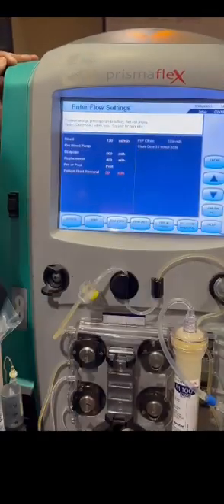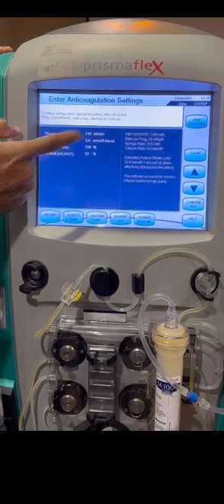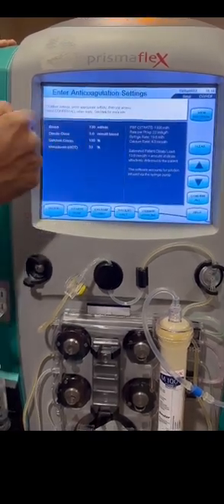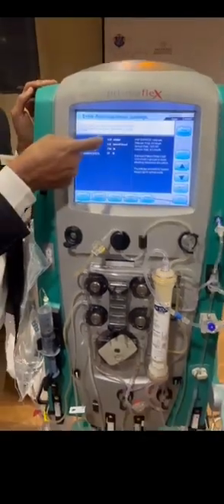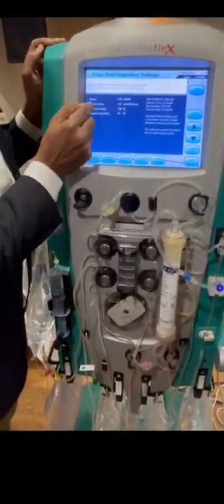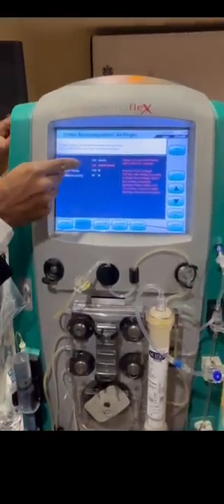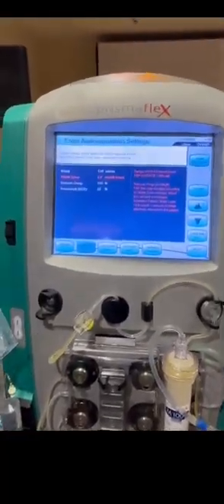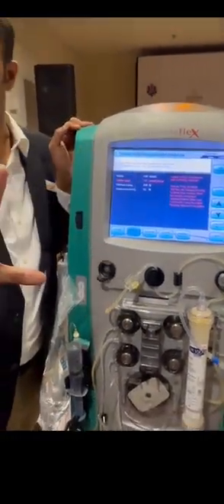Then I'm confirming. Now this is asking for the anticoagulation. Okay, anticoagulation we choose. If we choose heparin, here the heparin syringe pump option will come, how to adjust that, how many ml per hour. But here now we have chosen this one, Regiocit, citrate. So citrate we are calculating in the name of citrate dose. In this machine it is available from 0.5 to 6 millimole per liter. So here now 3 millimole is the usual dose as per the studies.